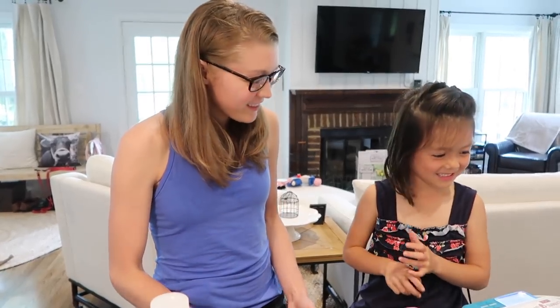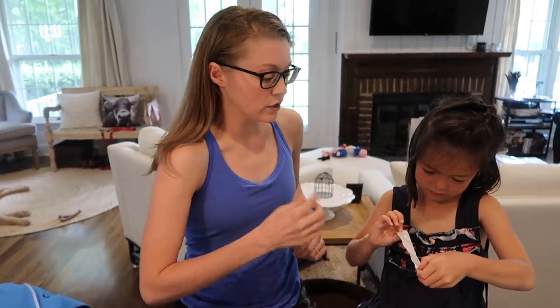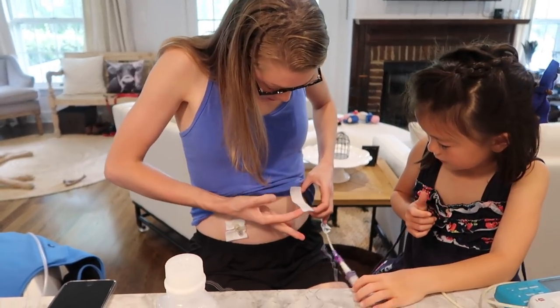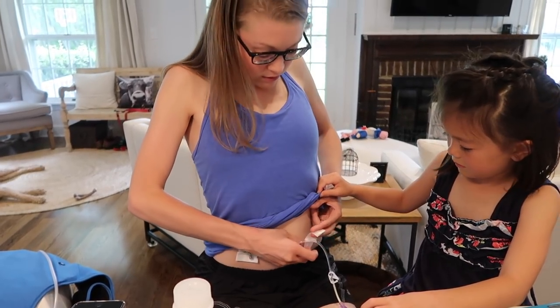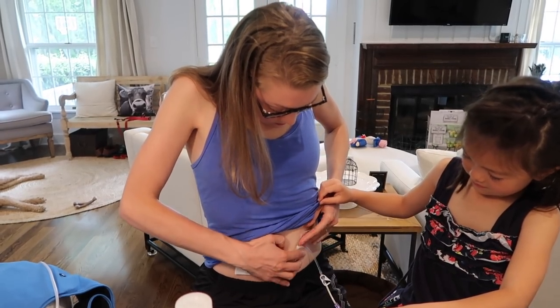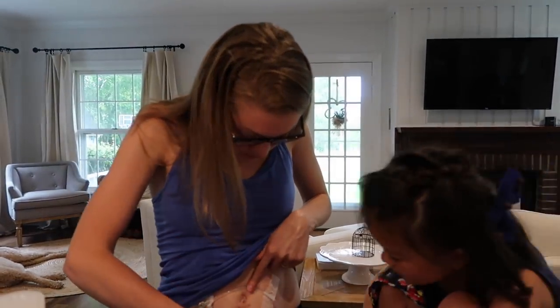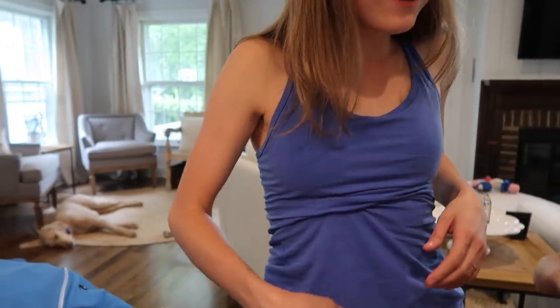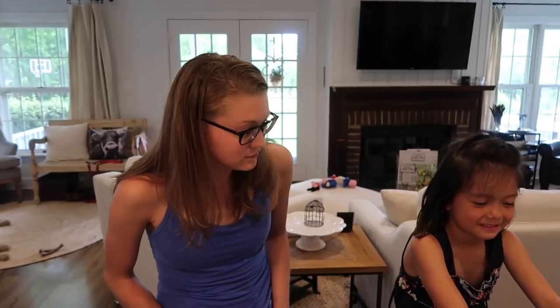You did it! What do you think? Good job. And then I just need to tape my tube — once you pull that off. I'm going to take the tape because it can fold on itself pretty easily. So the way that I do it, I just stick it in here, squeeze it to itself, and then sit up straight so my skin is stretched out. Does it hurt? Nope. When you take it off? Barely. So then this is one of the scars from the surgery — so they opened it up here, and there, and there, and put a hole here.